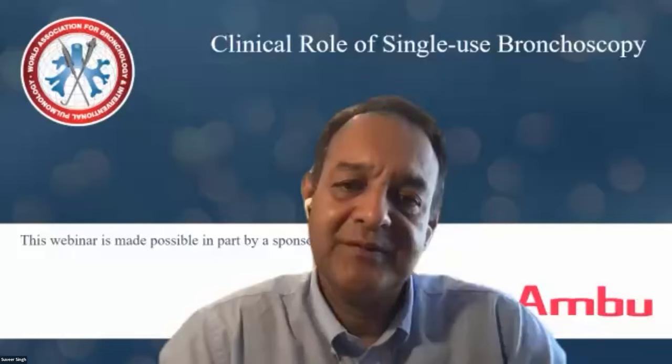So I think as the scopes get better and better and you get more confidence in being able to do the high-end work, like the airway tumor obstructions, and you have that good control and vision that you need when a bleed happens or whatnot, then you'll easily start transitioning into that. And then hopefully we'll be getting EBUS scopes very soon. And that causes even more damage than your regular scopes with the fellows. We won't have to worry about those punctures anymore with the needles destroying the channels. So I think it's a very easy way to incorporate it into those practices where there are a lot of fellows in education. I don't know, Jonathan, how do you feel about that?